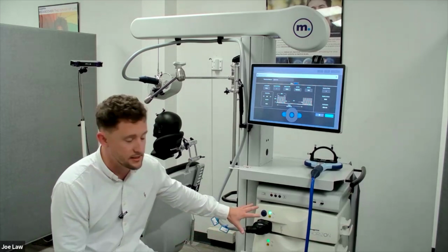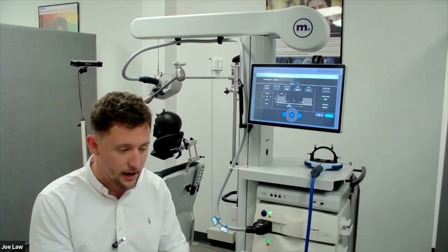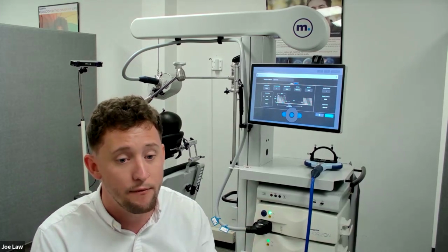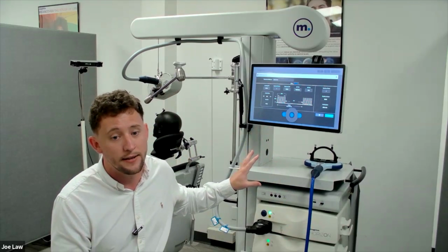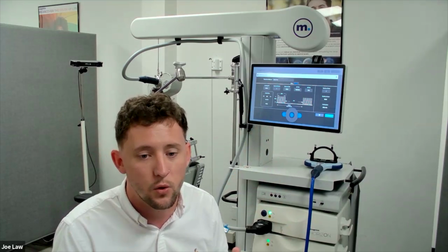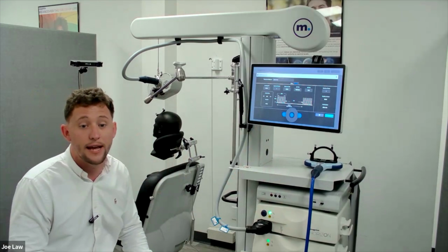The way our system works is there's an abundance of references within this system. So it looks at capacitance, voltage, current, all these kinds of measurements, and makes sure everything is still within tolerance. If anything steps out of tolerance, the system will display it to the user straight away. If it's something related to safety, the system is not going to allow you to continue, to make sure the system fails in a safe state. If it's something minor that the user can still continue working with, it'll allow you. It'll probably just warn you that maintenance is required, for example. But there is no process needed for measuring the output of the coil.